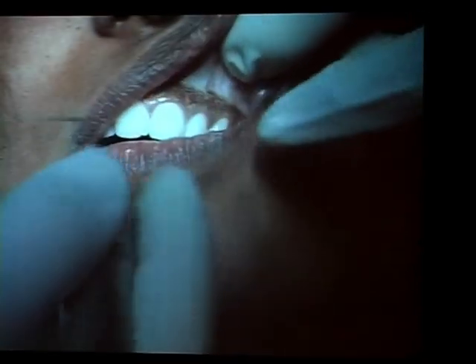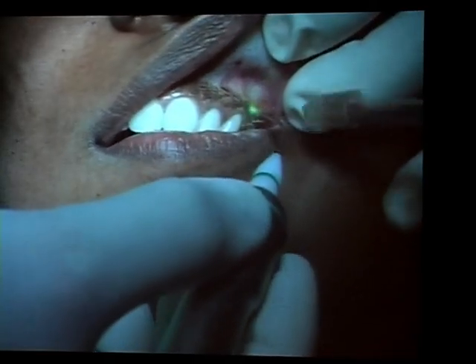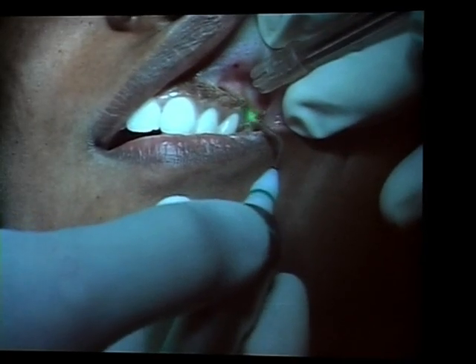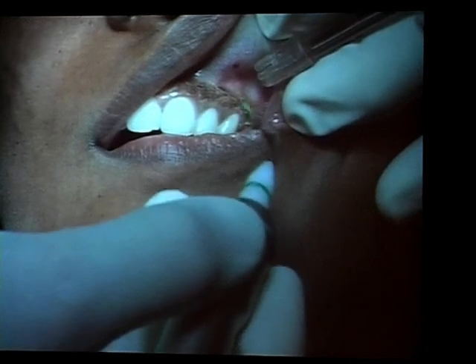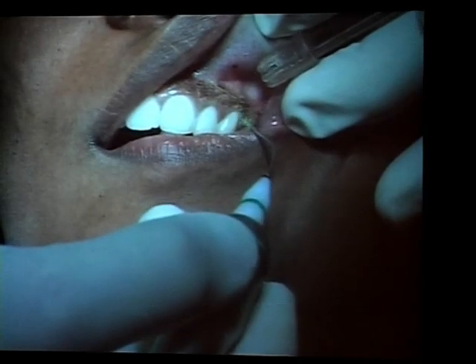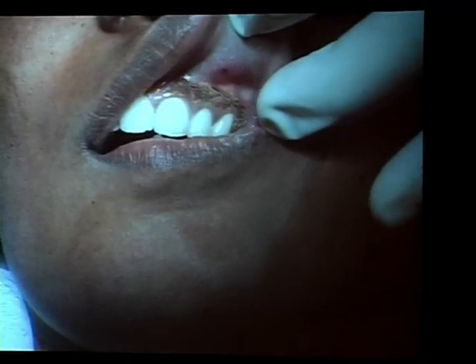And remember, this is continuous wave mode. Okay, take a look at it.